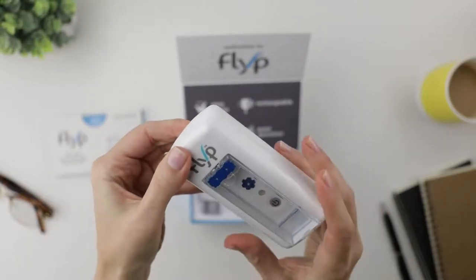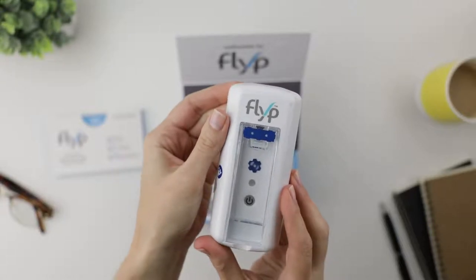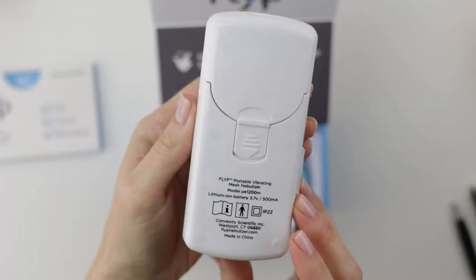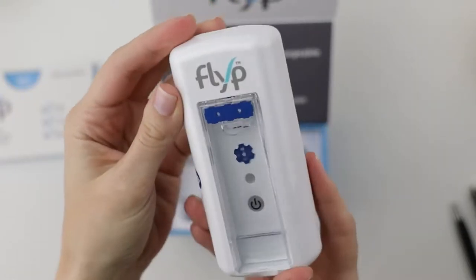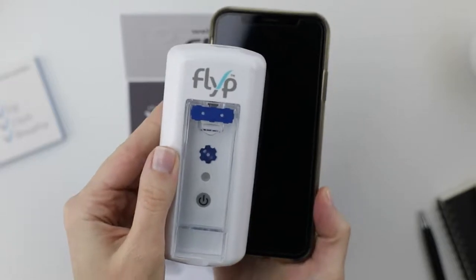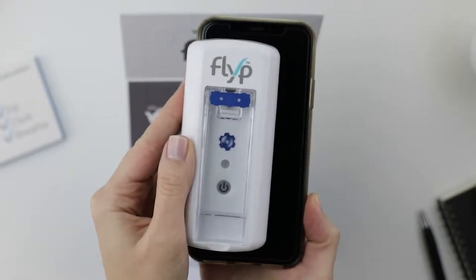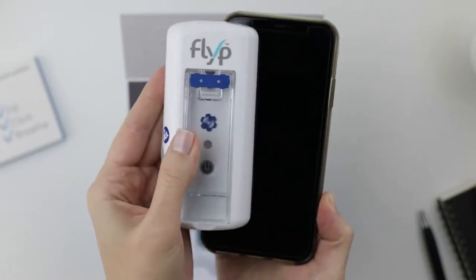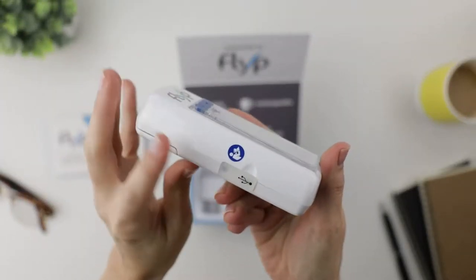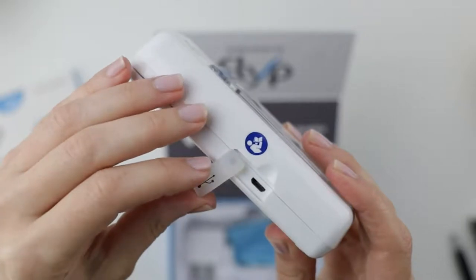Okay, here it is. Wow, way different from my current nebulizer. No tubes, no control units, nothing to assemble. Awesome. And look at this — it really is smaller than a smartphone. Unbelievable. No problem taking this one with me. And here is the USB port. I know how to use one of those.